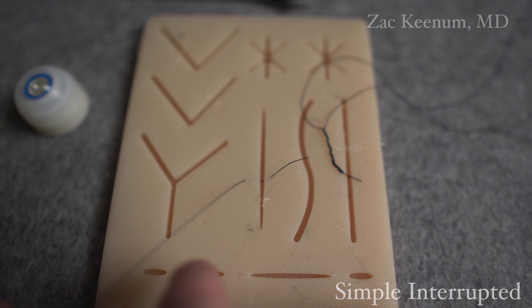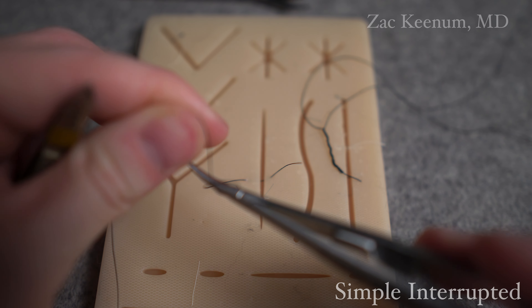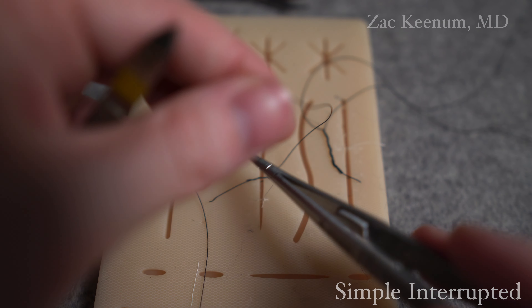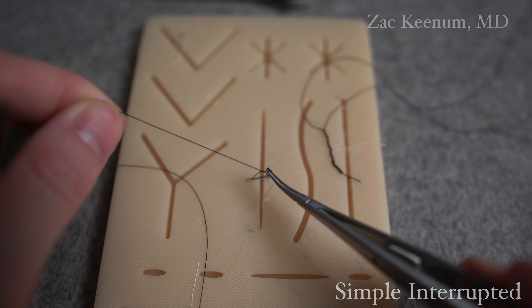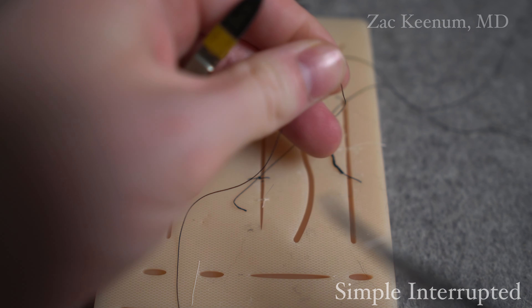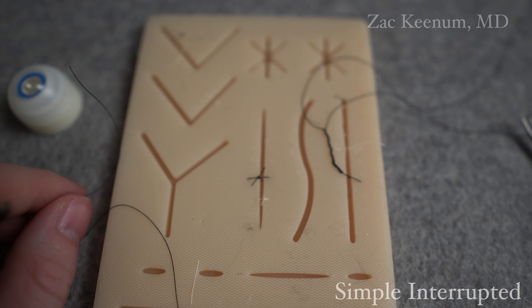Using a surgeon's knot, 2-1-1, we pull this through until there's just a small tail left - just enough for us to tie to. I grab this in my non-dominant hand, my left hand. Now I take my right hand with the needle drivers, put it inside the loop. I do a 1-2 wrap. I grab the tail, cross to lay it down flat. For my second one, I come from within the loop - do a 1. Remember 2-1-1. Now we're doing the 1. Cross again. And for the last one, I come from within the loop one more time, crossing so that it lays down as a square knot. Then I cut the tails of my sutures, just leaving a little bit. So now we have a simple interrupted suture.